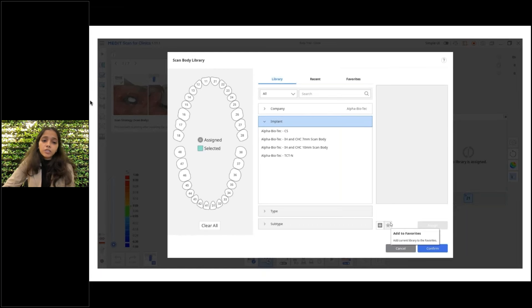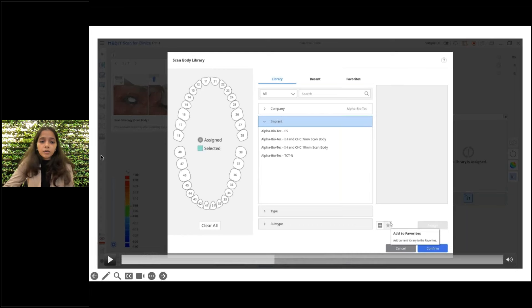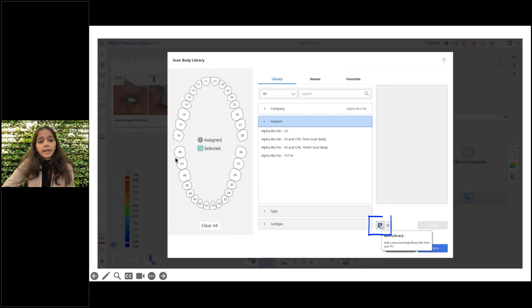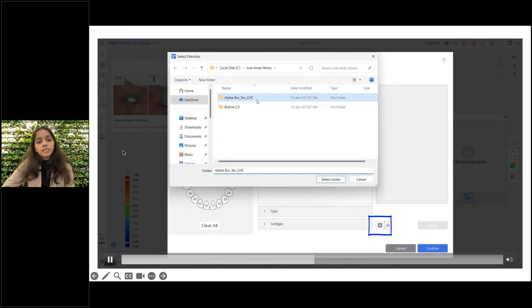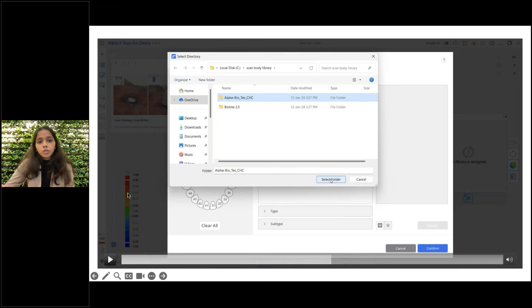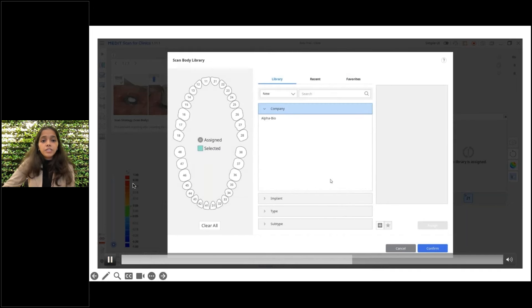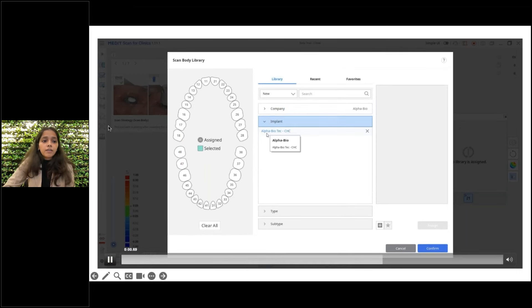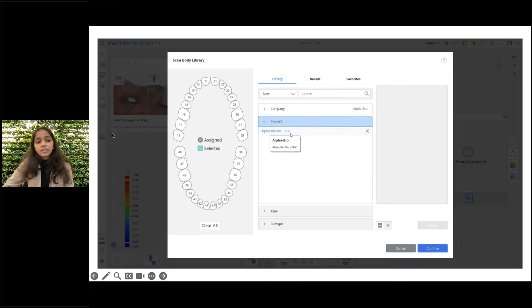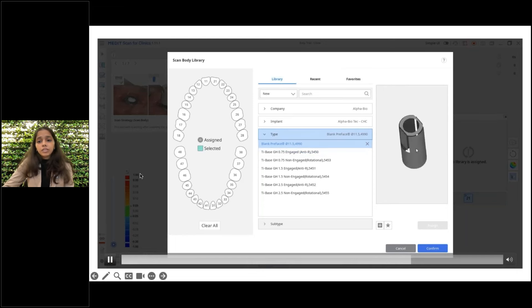I just need to get that file with its supporting files and import it into the Medit software. I can add the library from the plus button — and this is very important: you have to select the folder, not only the CAD file, because the scan library consists of other information like implant details and supporting documents that come with it. So always import the folder, not just the scan file. Once you select it, your scan body will be imported. Now I have the Alpha Biotech CHC available — I can select it, assign it, and proceed with my scanning.